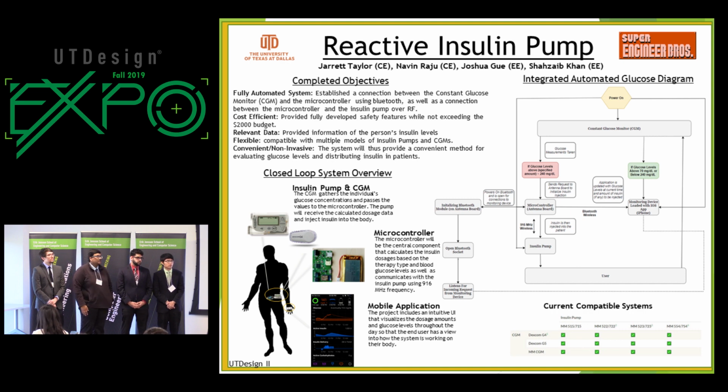So your application currently is monitor only? Monitor and input. It will automatically check on your glucose levels, and if it is above or below a certain range that you put into your settings, it will notify the pump to automatically input a certain amount based on our algorithms for the dosage recommendations.